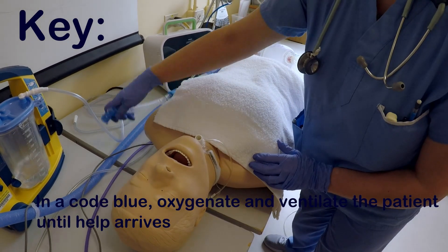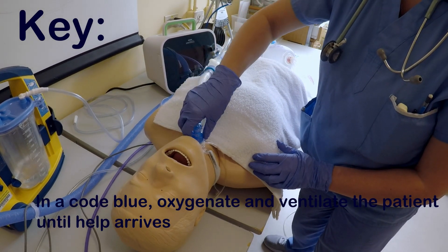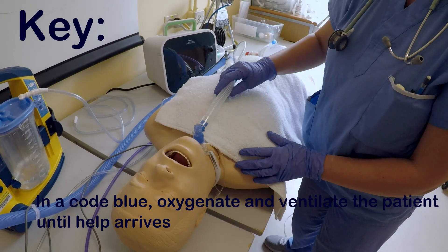In a code blue, our role is to oxygenate and ventilate the patient until help arrives.